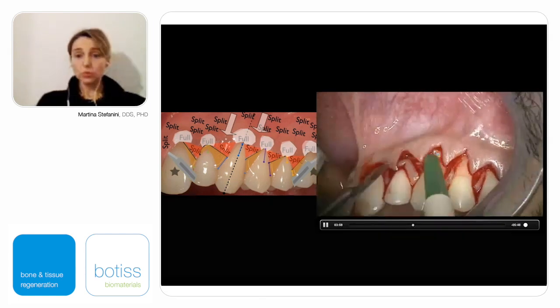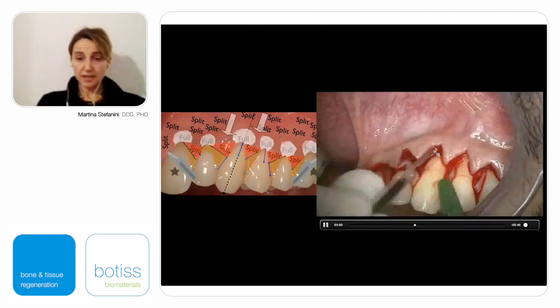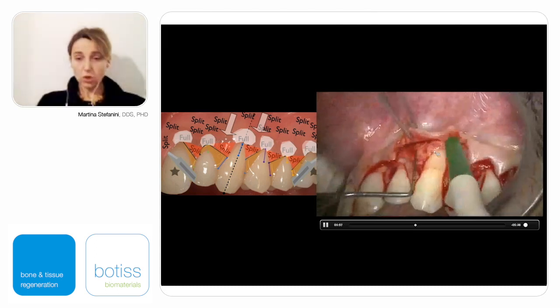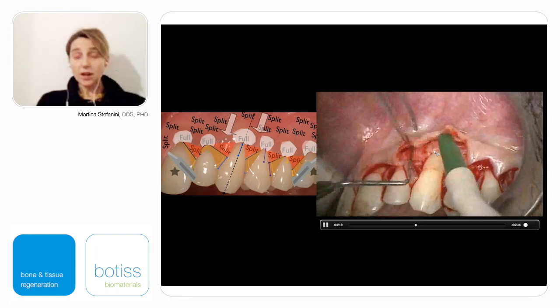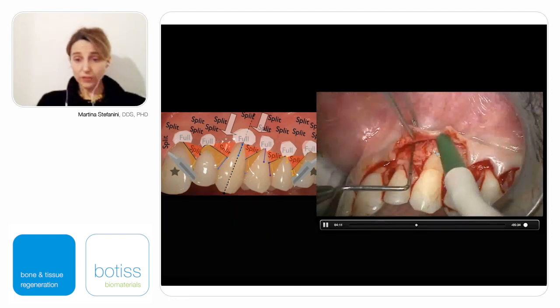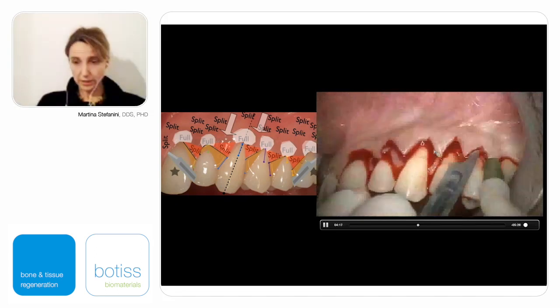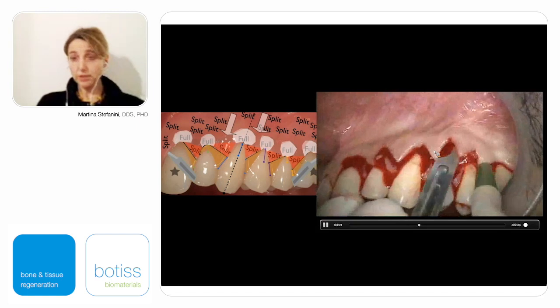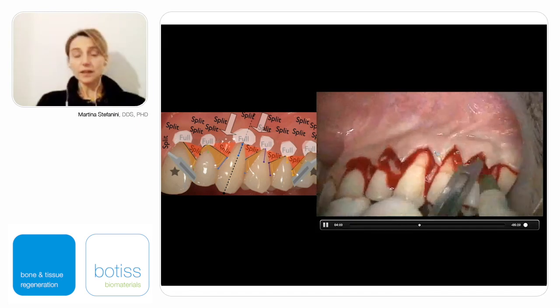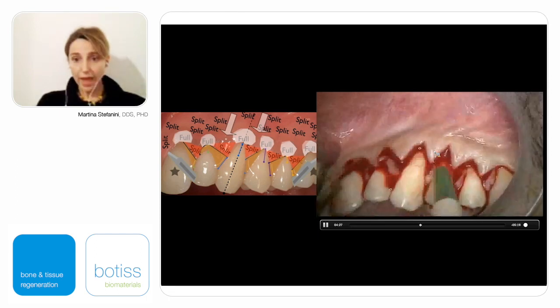We need to go beyond the mucogingival line with the deep split thickness incision to detach completely the muscles from the periosteum. Now you can see with the probe that after the separation of the muscle from the deep aspect, we are able to change the inclination of the blade that now can be maintained parallel to the external surface, parallel to the flap.